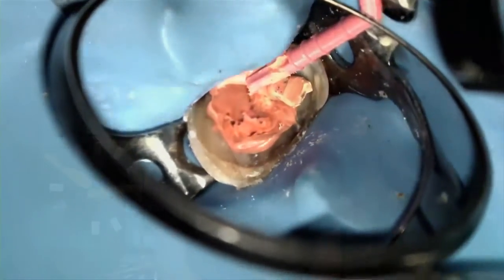This is optional, but in large canals, and as you may see in this clip, I like to downpack the warm GuttaCore gutta-percha around the cold gutta-percha in order to provide an even better obturation.